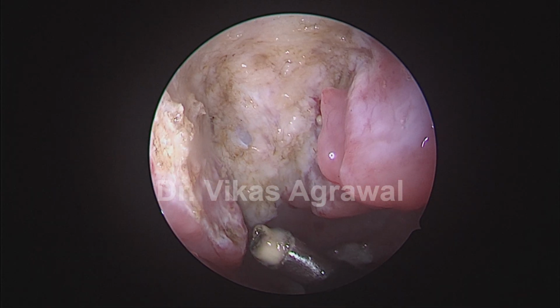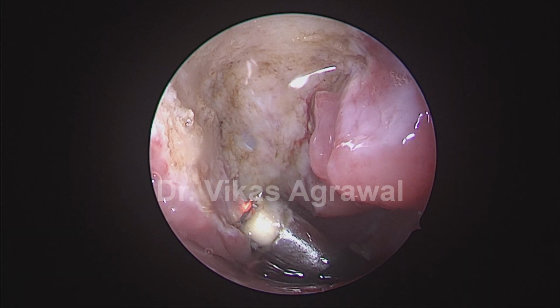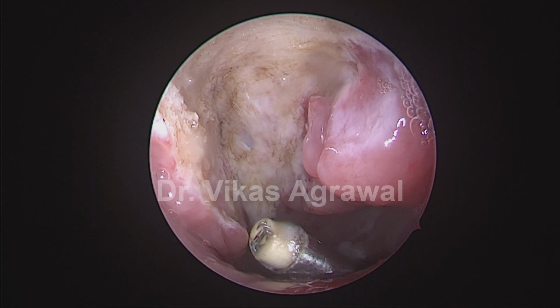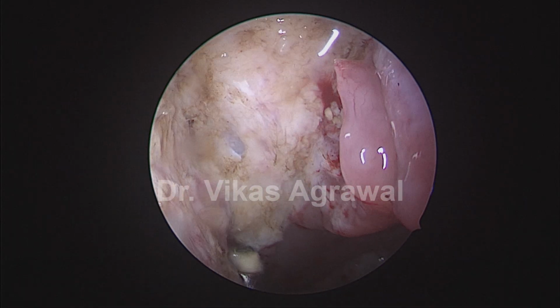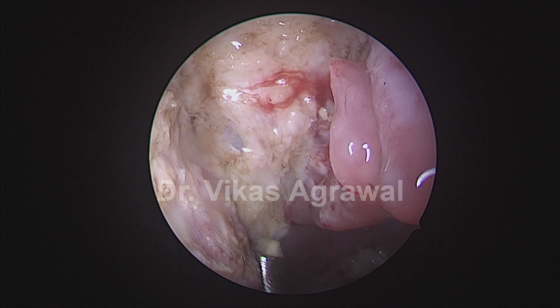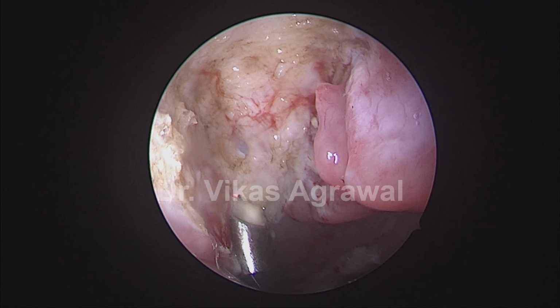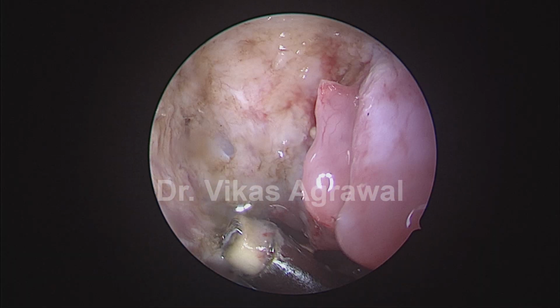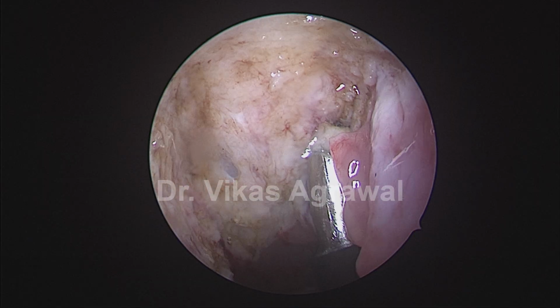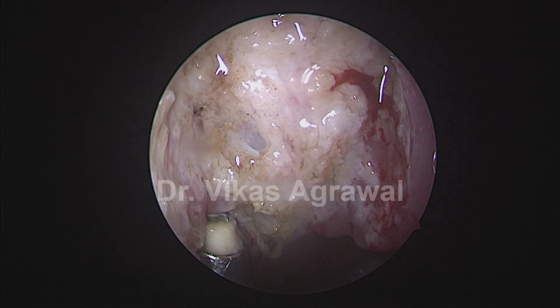Now you can see the torus tubaris. Still there is some amount of lymphoid tissue. Alright. And that's the Passavant's ridge area. That's the Passavant's ridge area.